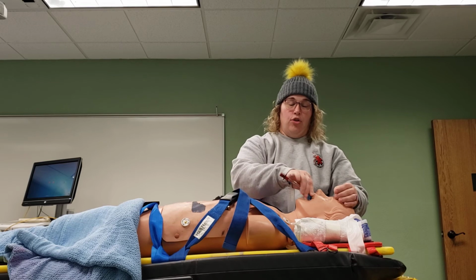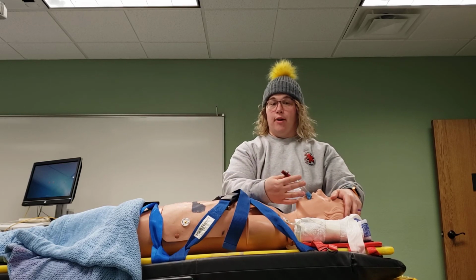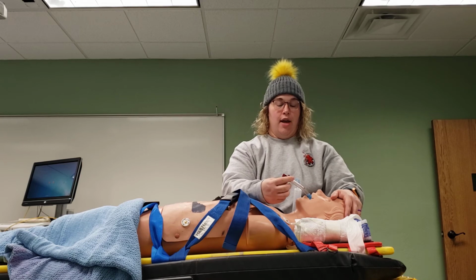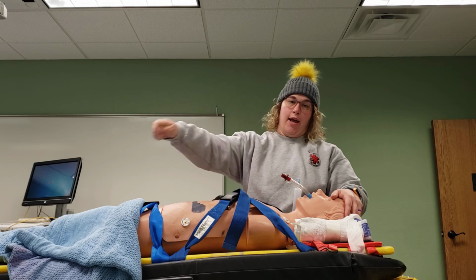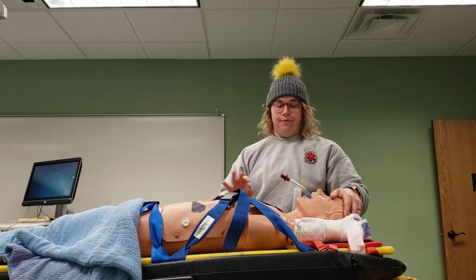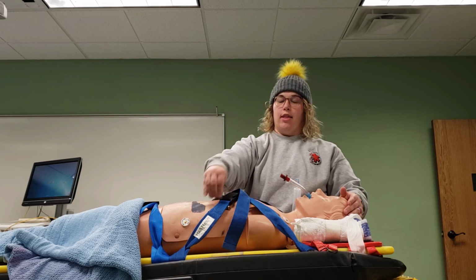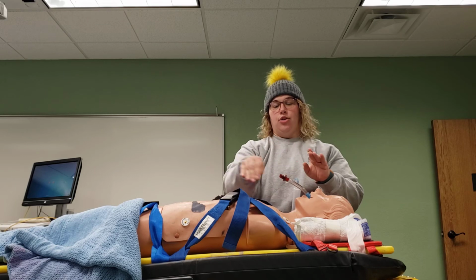You want to have 2 ways to confirm that advanced airway. So we want a colorimetric CO2 detection device, a bulb device, which isn't as popular now, it was in the old days, or waveform capnography, which is considered the gold standard, where we're plugging it in, as we saw in class, to the monitor and seeing that nice, beautiful waveform. We also want to have a stethoscope at the ready to be able to listen to the stomach first and then to the 4 points on the lungs. And someone will be ventilating quickly so you can listen.